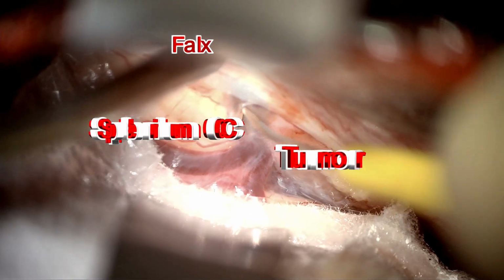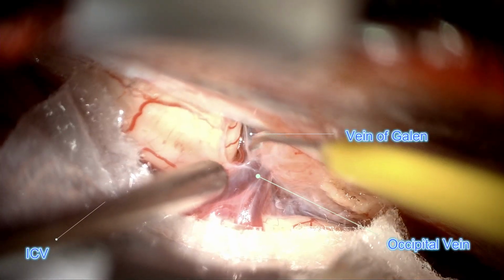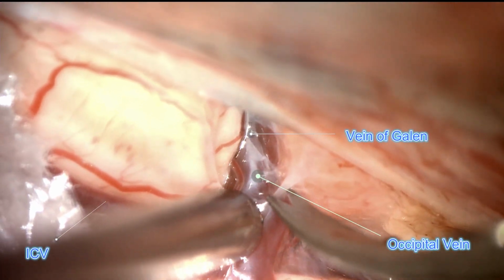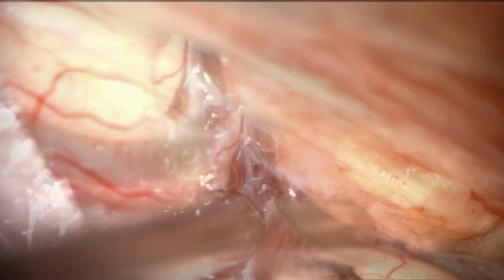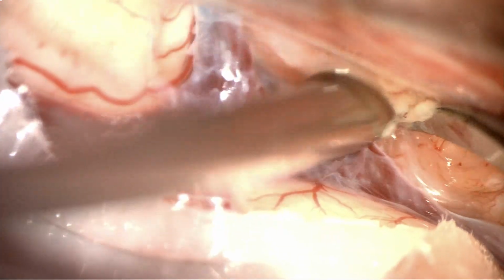In this case, a retractor is placed over the falx to allow visualization at depth, and the brain is covered with a tuft. Here in this picture, we can find the corpus callosum, the vein of Galen, the ipsilateral internal cerebral vein, and the occipital vein that are pushed forward by the tumor. Now the quadrigeminal cistern needs to be opened to identify and protect these structures.